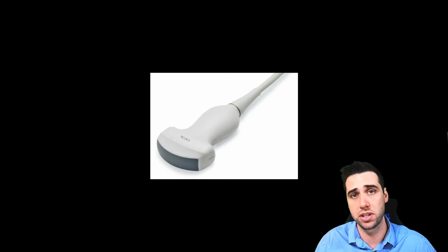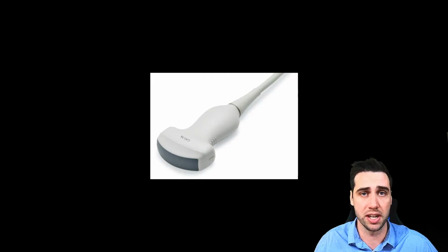So first things first, I usually like to use the curvilinear probe for the majority of my lung exams. You can use the phased array. Linear is really only useful for lung sliding though.